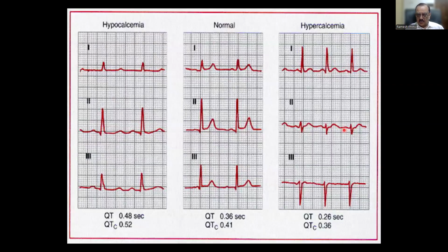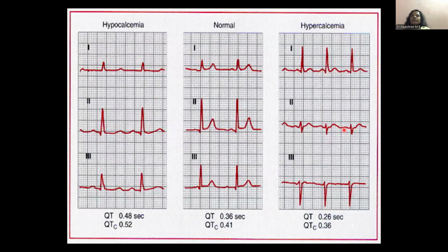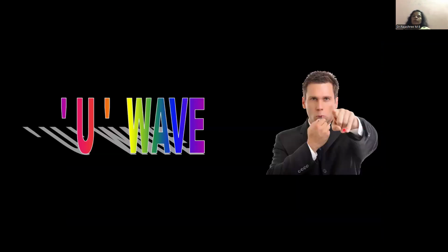Any doubts in the QT interval? No, sir. Okay. The next wave is the U wave.